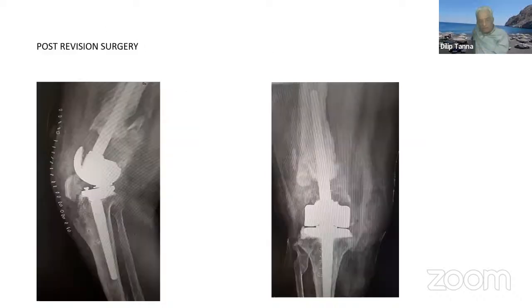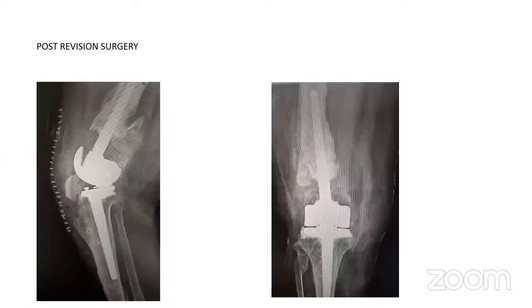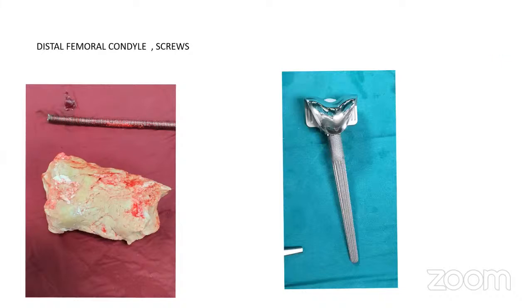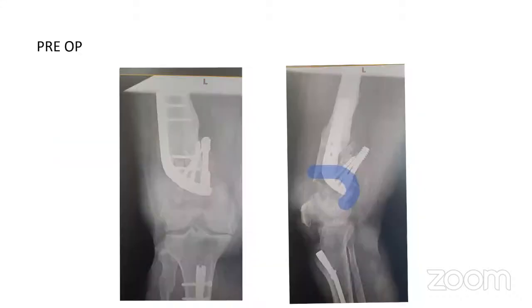But that gap which is there in between, can you just go back? Between the distal end of the femur and the prosthesis, what is there? This one, there is a spacer from the Link company, and it is not seen on the X-ray, sir. This is the prosthesis. Yes, there is a spacer when we actually put it. This rod, which is hydroxyapatite coated, can go in. And this is the only femoral part of the prosthesis which I have put in. Okay, there is a joint. I just wanted to share that.